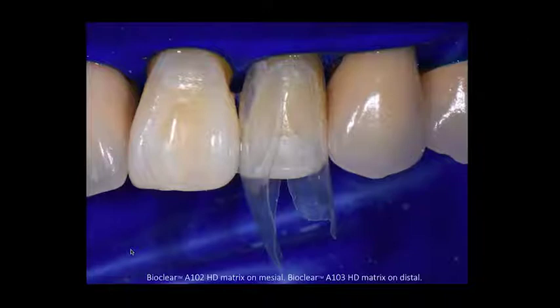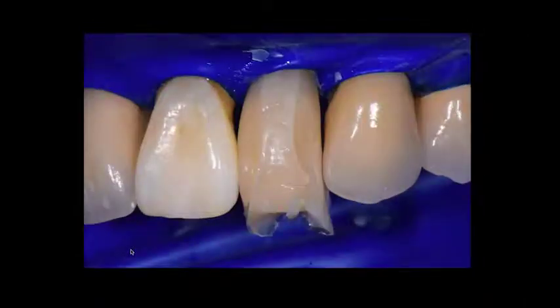So here we have that tooth with the BioClear anatomic matrices in place. For those of you that are familiar with BioClear, I have an A102 HD matrix on the mesial and the A103 HD matrix on the distal. So this is how we create our anatomic form into which we injection overmold our composite. And the shade that was selected for this restoration, I believe, was A3.